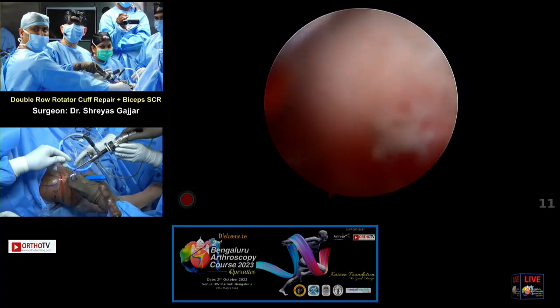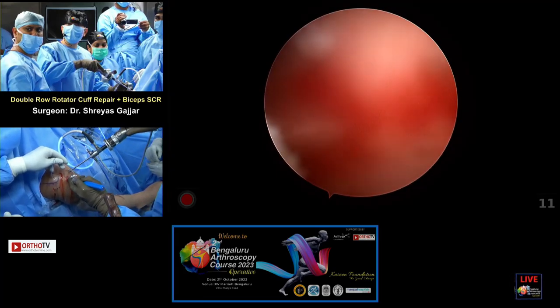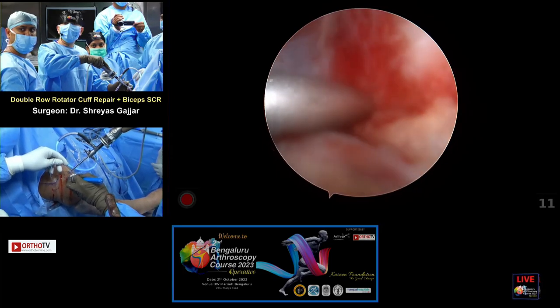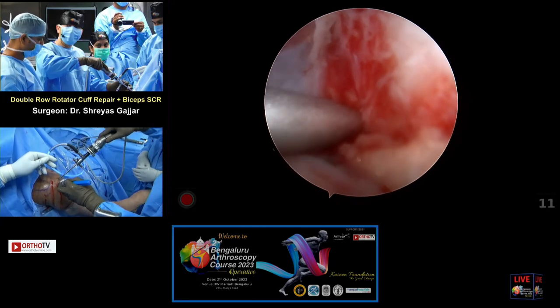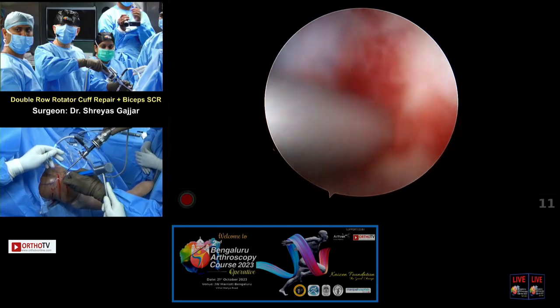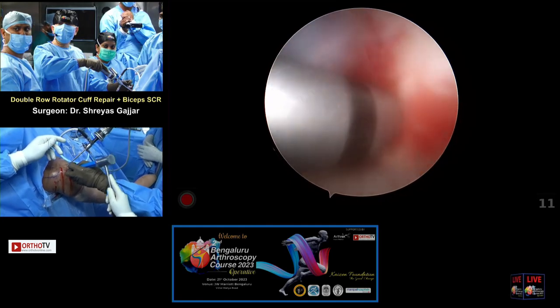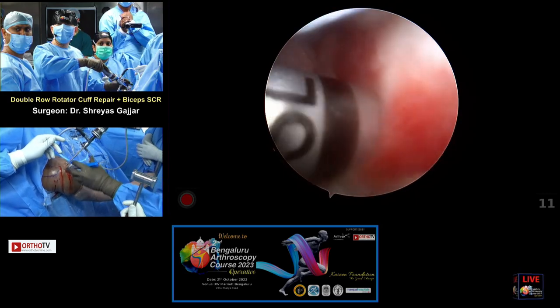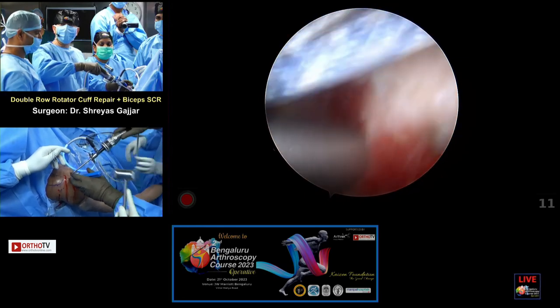Gently. So if it's bleeding and you are at a crucial point, you can bring the camera closer so you do not lose the vision. Gently hammer, please, sister. Gently, like before. Yeah, very good. Okay, just hold on, stop, please. I want to see my alphabets. Yeah, go on slowly. Slowly, slowly, little more. Yeah, perfect, thank you. Anchor, please.